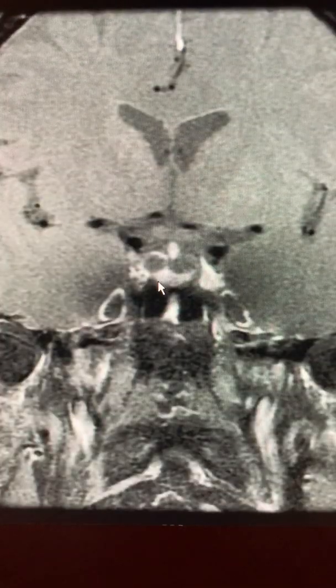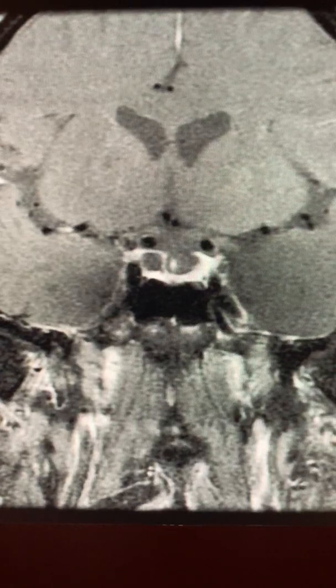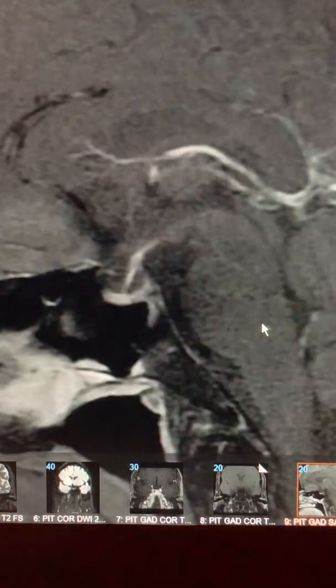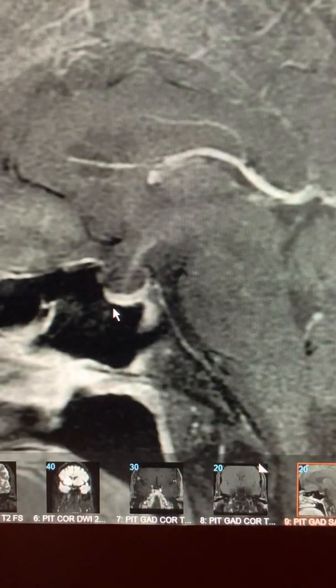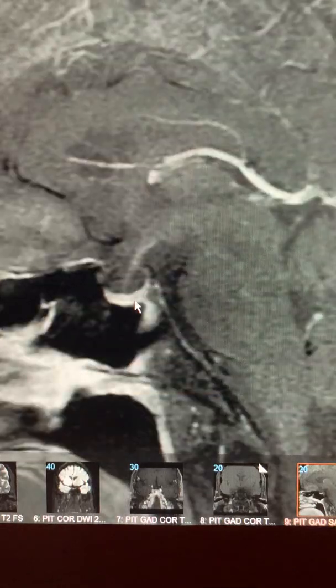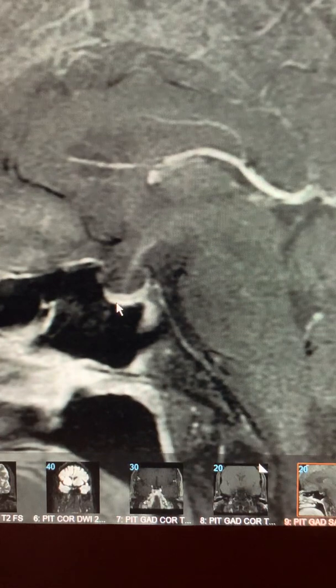It could be an arachnoid cyst, but probably not a Rathke's cleft cyst because it's not in the region of Rathke's cysts. Now if we look at the sagittal films here, you can see the pituitary is flattened. It normally should be as high as where the arrow is here, so it's probably one-fifth the normal volume of the pituitary. This confirms the empty sella. You can see the stalk going all the way straight down to the floor of the sella where the pituitary is located.